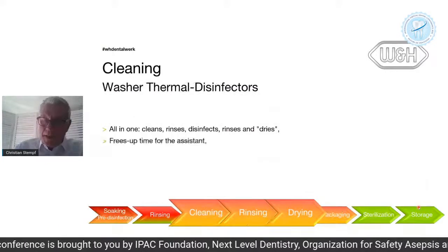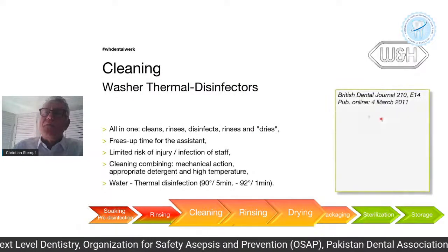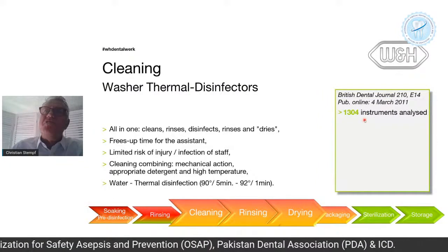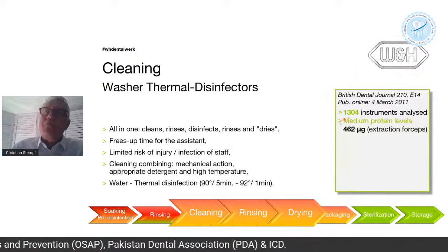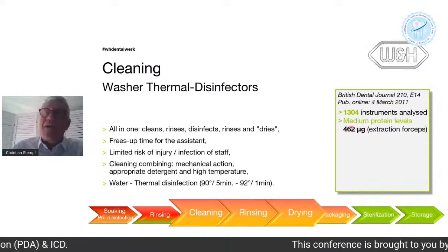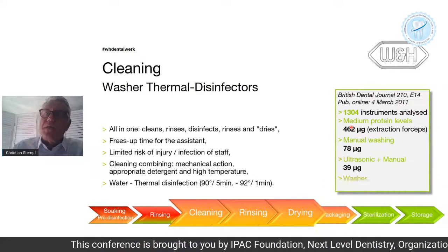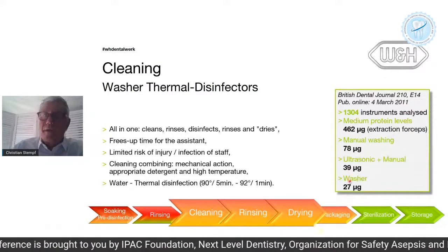On the right-hand side here, this shows you the efficiency of the three techniques. When we talk about clean, it's not only visually clean, but you want to measure the residual protein level on the instruments. This is before cleaning, after manual cleaning, after ultrasonic cleaning, and after washer. You see here, this is much, much better.